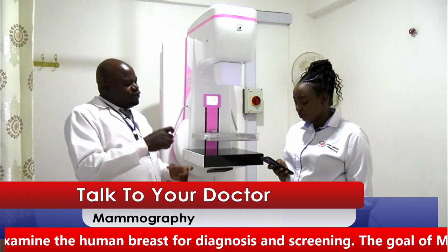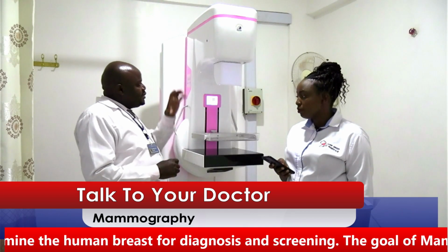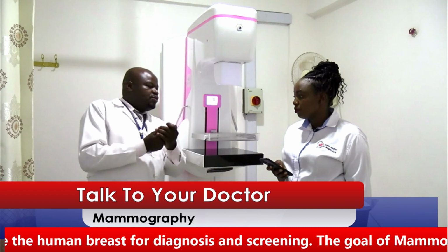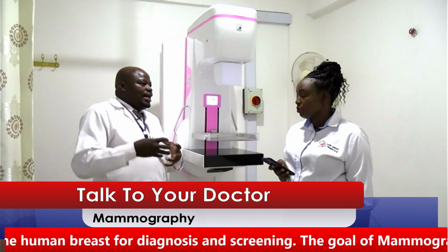And that's what I'm saying. In early stages, at least the mammogram will be able to demonstrate those small tumors that cannot be palpable.